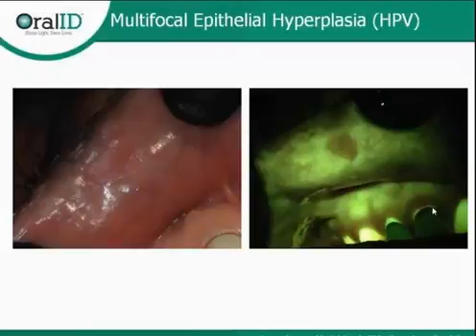At the margin of the crown here, also you can see that there's a little pink area. I don't know if that's just plaque or it could be recurrent decay. But when you're doing your soft tissue exam, look at the hard tissue, shine the light on the margin of the crown. You never know what else of interest might jump out at you.